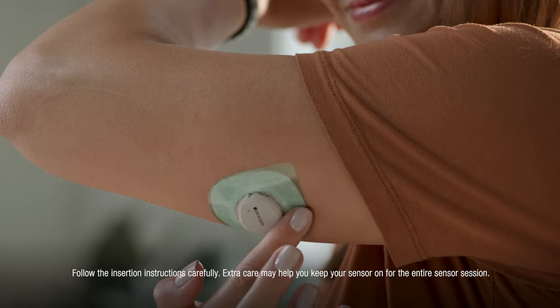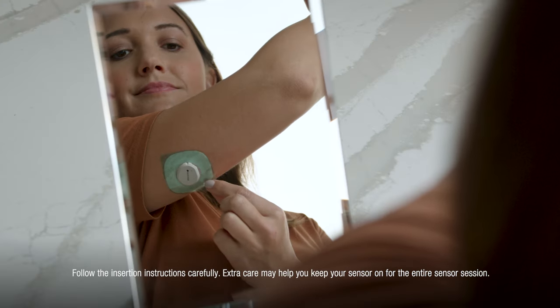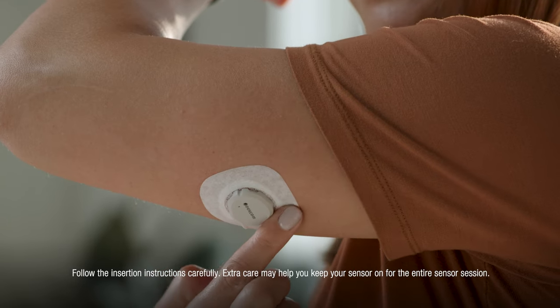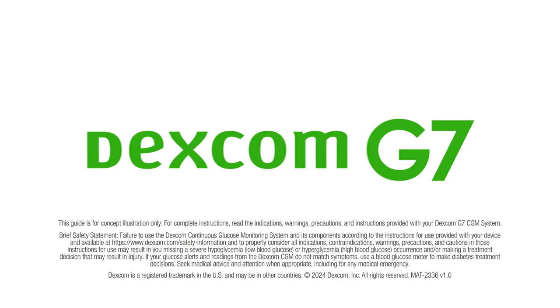Rub around the overpatch. Use the tab to peel off the colored liner. Then rub around the overpatch. Your sensor and overpatch are now complete.